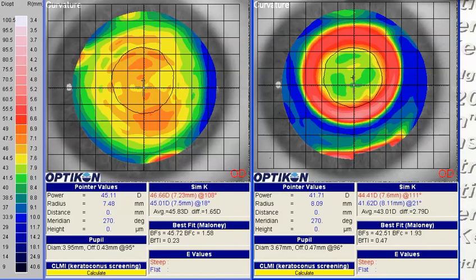Here we're troubleshooting an orthokeratology case. This patient initially had complaints about glare and reduced visual acuity after lens dispensing. And you had already made some changes to the lens, steepening the periphery to get slightly better centration of the treatment zone. The lens looks like it still fits a little bit loose in the vertical meridian, but you're getting excellent centration right over the pupil.